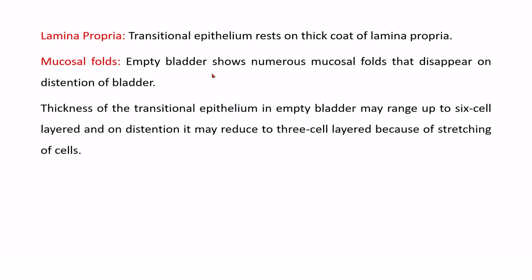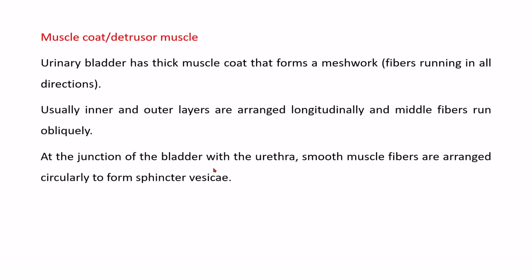An empty bladder shows numerous mucosal folds that disappear on distension of the bladder. The thickness of the transitional epithelium in an empty bladder may range up to 6 cell layers, and on distension it may reduce to 3 cell layers because of stretching of cells.